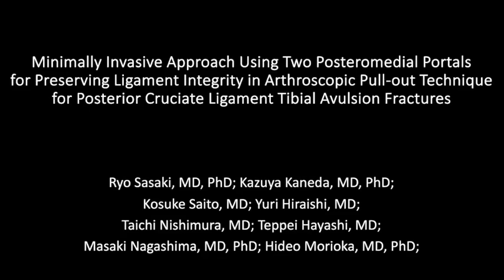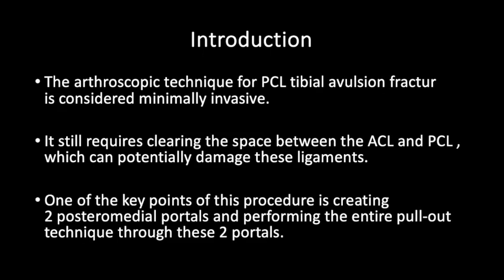This video introduces the minimally invasive approach using two posteromedial portals for preserving ligament integrity in the arthroscopic pullout technique for posterior cruciate ligament tibial avulsion fracture. We have no disclosure.